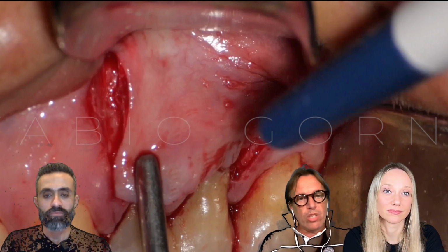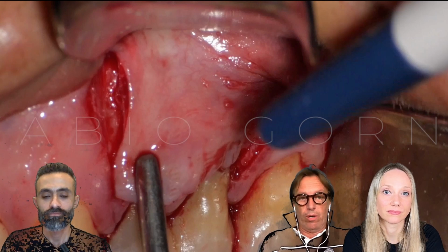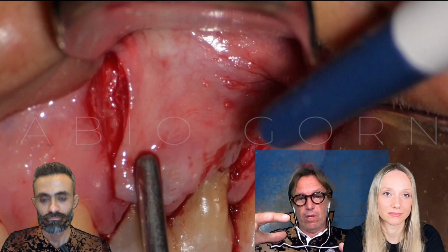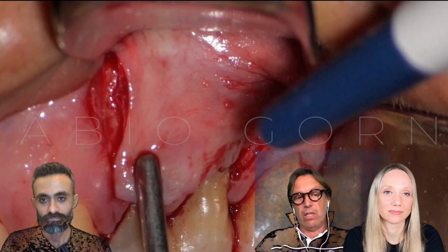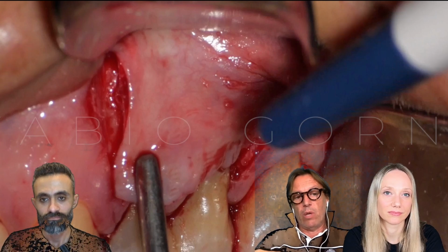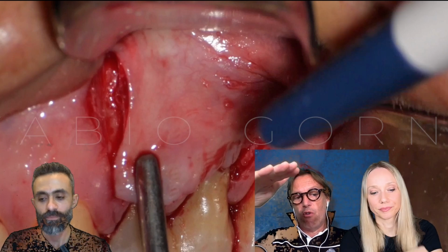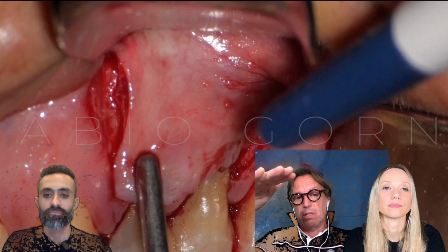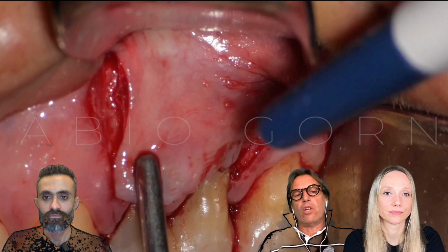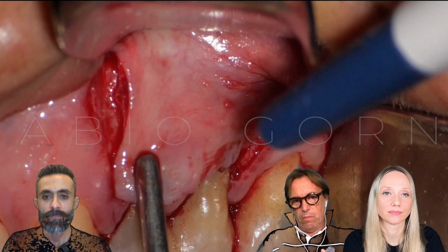And using BC putty all the time, I'm not sure, because when you touch it, the material moves up and down inside of the cavity, and it's a big problem in my opinion, especially when the cavity is more than 3, 4, 5 or more millimeters. It's not easy to condense, so I don't love it, but it's my problem.